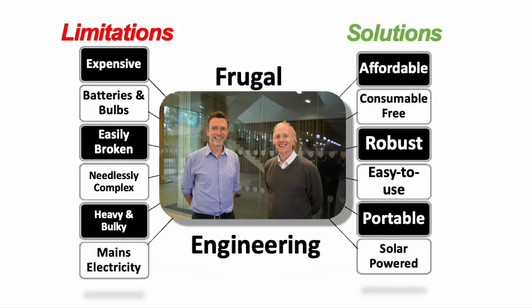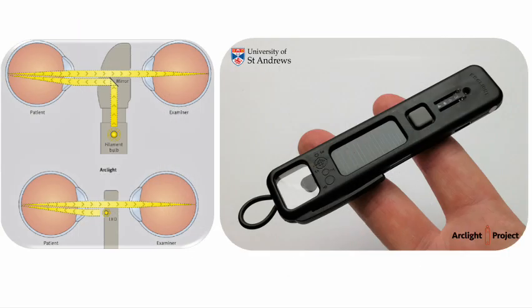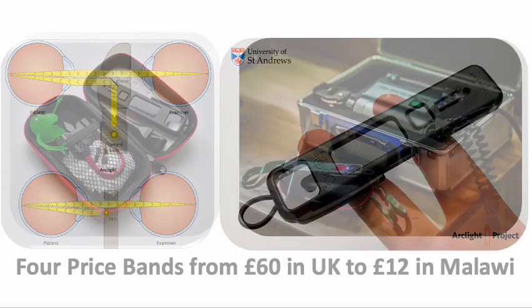With William J. Williams, an optometrist and frugal engineer, we are addressing the limitations of orthodox diagnostic tools to widen access in resource-poor settings. The first device I am presenting is the Arclight, a direct ophthalmoscope and anterior segment loupe. It uses a radically different frugal design to that of traditional devices, placing an LED light source directly below the sight hole. This reduces cost and size, as well as allowing it to be solar powered.